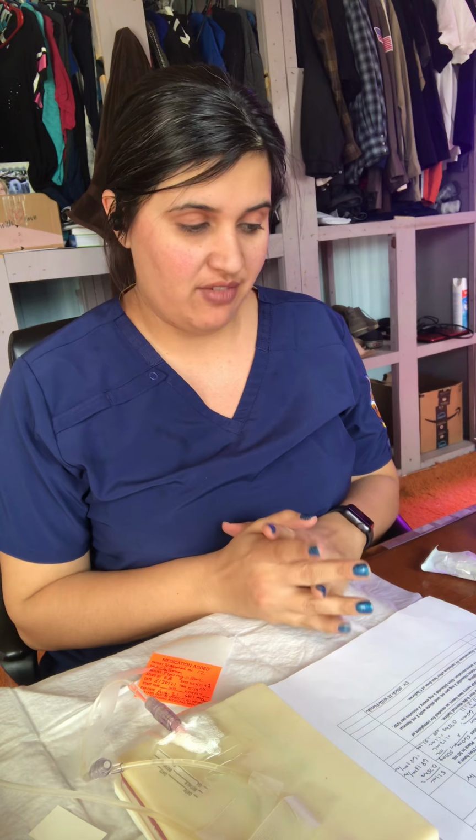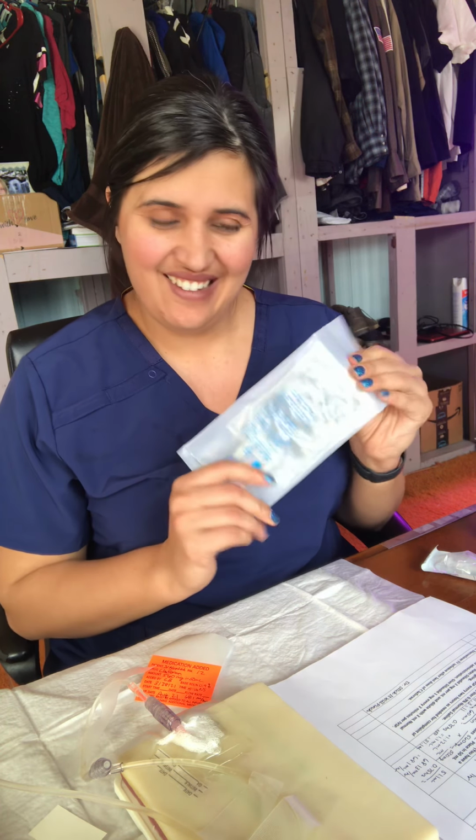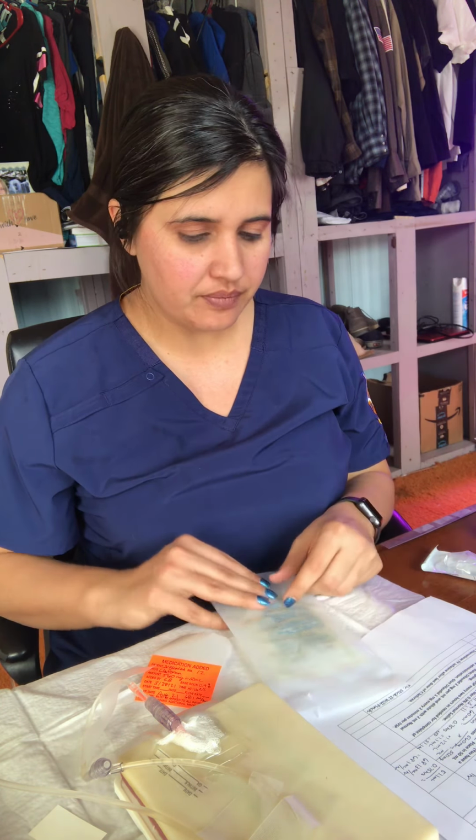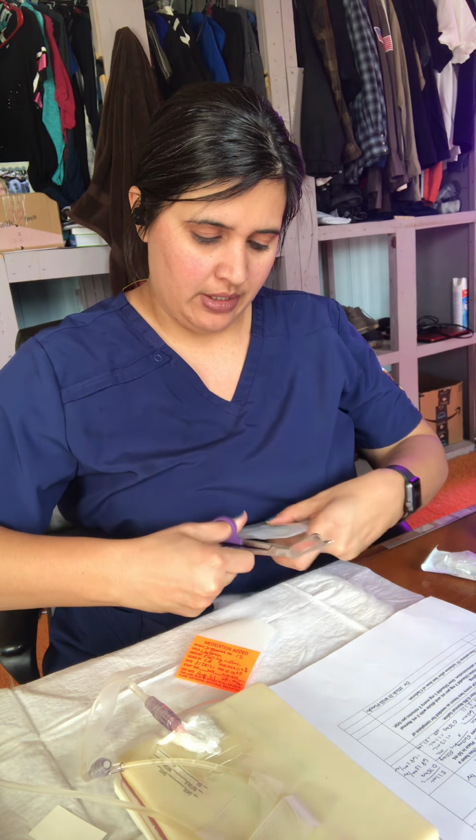I received an order for my patient, IV Claforan, as an IV Piggyback. I will be drawing up 560 milligrams and placing it in a 50 milliliter normal saline bag. I will draw up my medication label. I will remove this, the 50 milliliters.